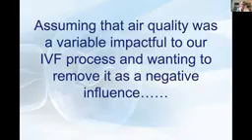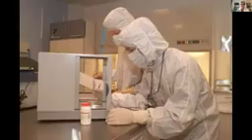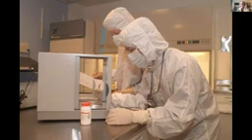And in the year 2000, we were asked to design and build a new IVF laboratory. And assuming that air quality was a variable that could be impactful to our process, we obviously didn't know then what we know now. We wanted to check the box. We wanted to remove it as a negative influence. And so we built and designed an ISO 5 or class 100 clean room from the ground up, thinking that if we culture our embryos in this space, we will remove that variable.